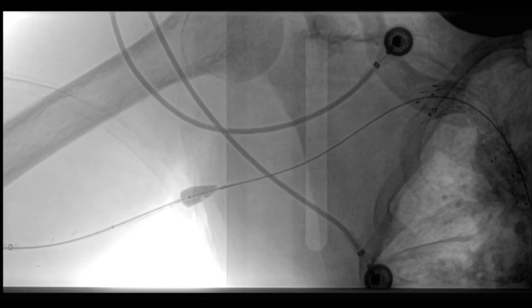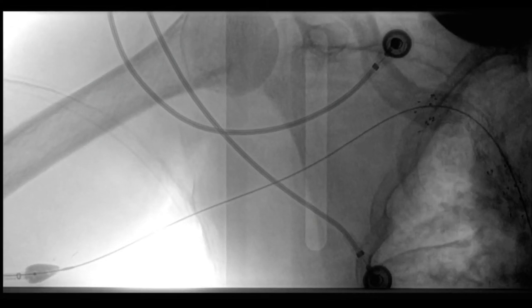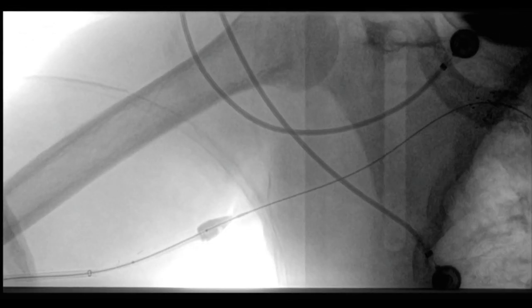Unfortunately, we were not able to retrieve the balloon through the sheath as the tip would not completely deflate. An empty syringe was connected to the balloon inflation port and negative pressure was applied to help deflate the balloon, but that didn't work either.